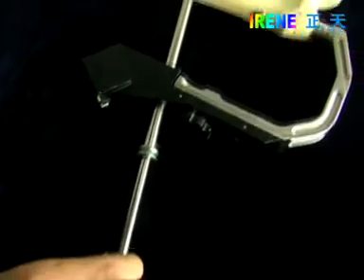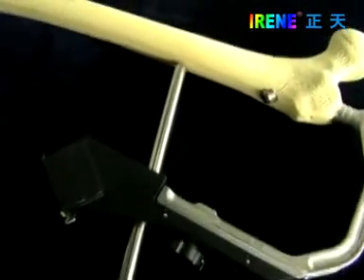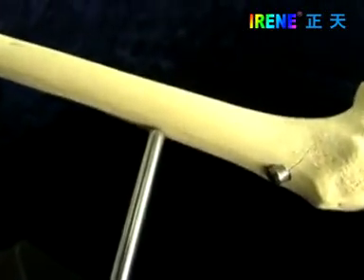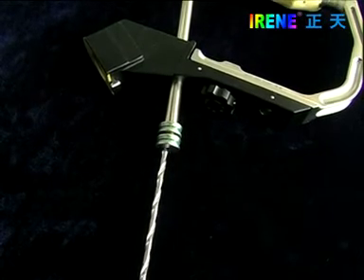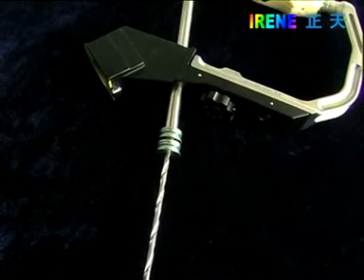Take out the pin and drill through both cortexes. The tip should be beyond the far cortex by 2 to 4 millimeters. The protection sleeve should be touching the cortex.